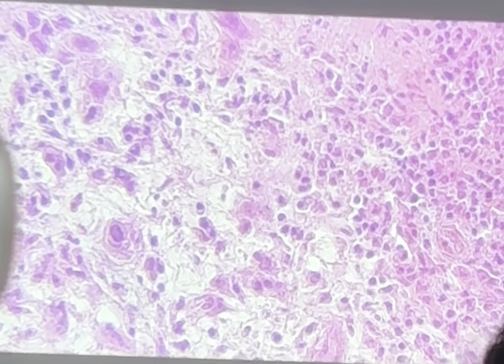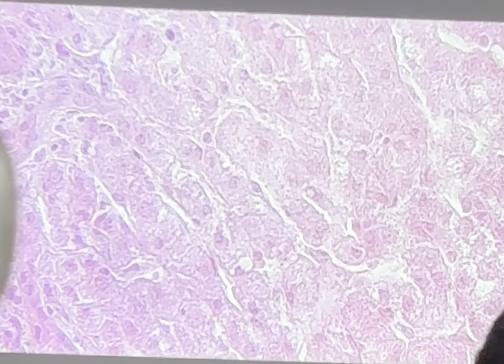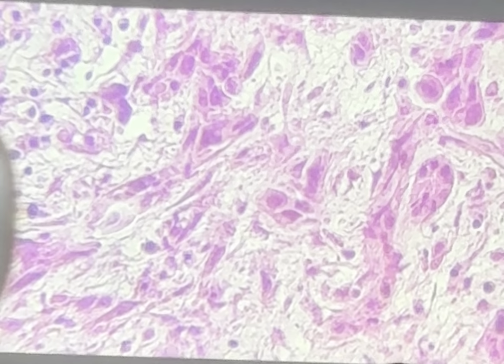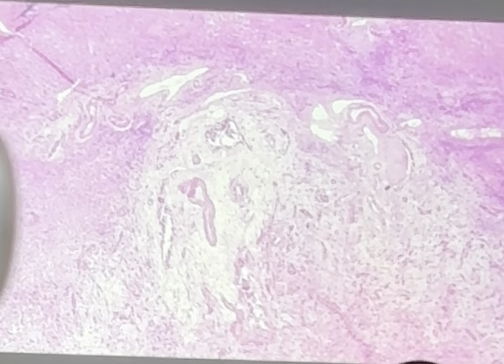For now, just be able to recognize, compare this one to the normal benign cells here. Okay? So look for pleomorphism, hyperchromatia, loss of polarity, etc. So this is cholangiocarcinoma. Next.